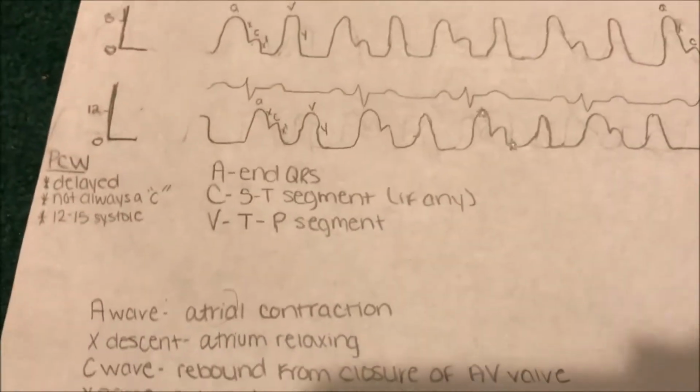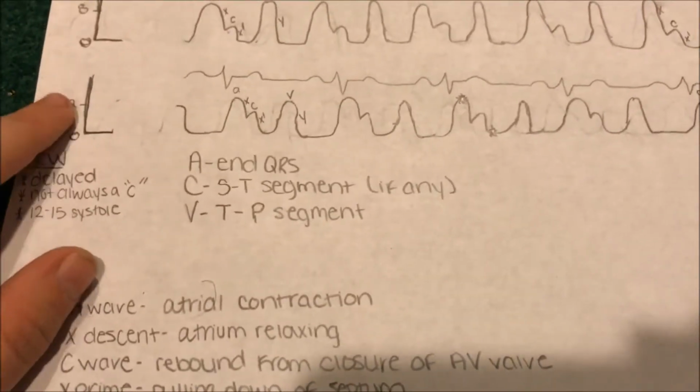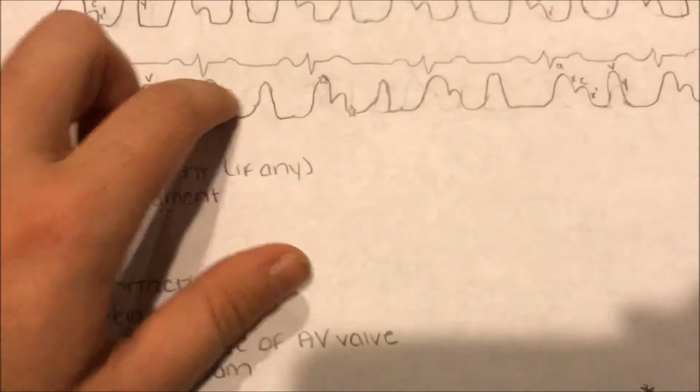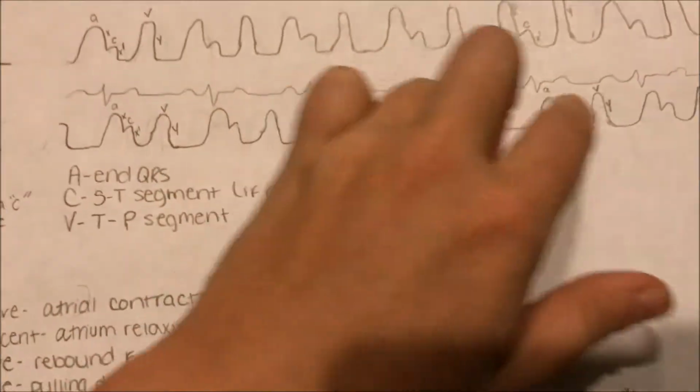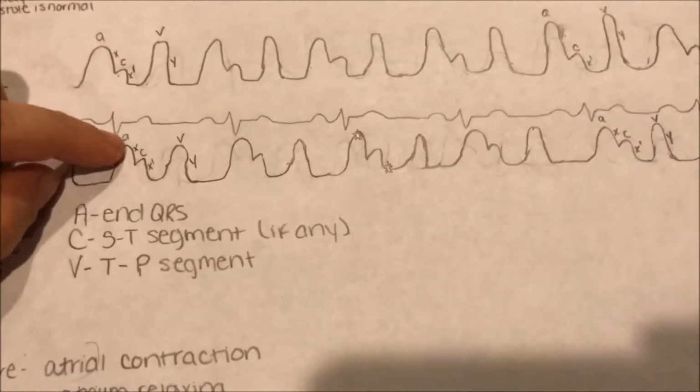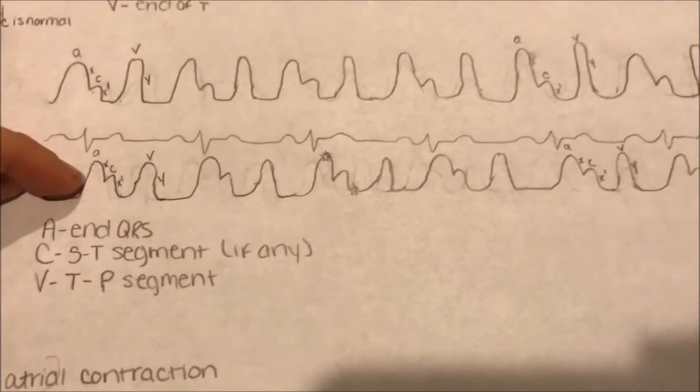And that's nicely done, because when we look about halfway through the 0 to 12, about right here would be the 6. If you slide your finger across, it's the very middle of all of these, which should probably be right about halfway through. You have the equal amount on top as you have on bottom. 6 is right in the middle. And that is our atrial waveform.